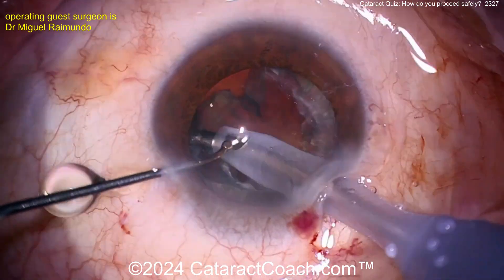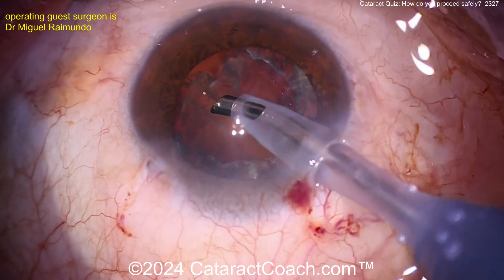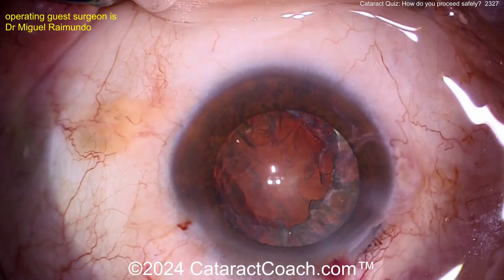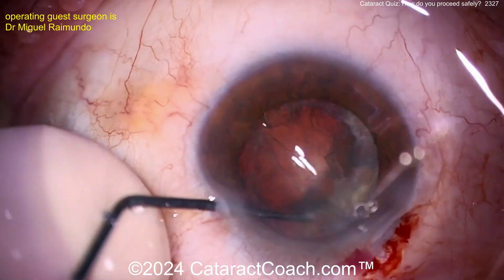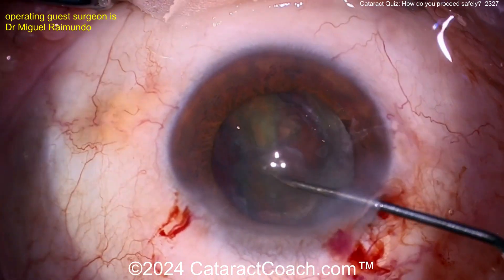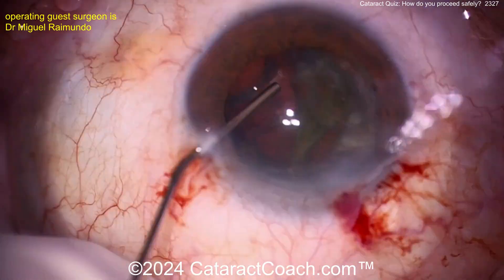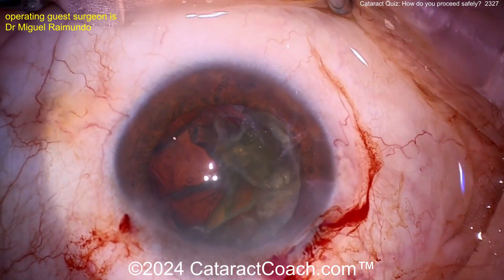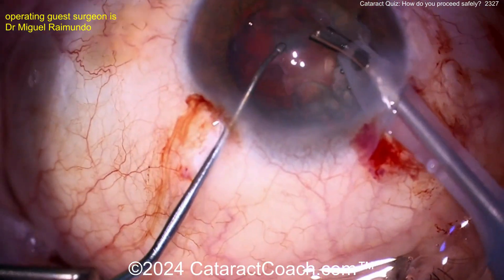When you get that shell out of the eye, don't just pull the probe out because who knows what's happening with that posterior capsule. Intravitreal injections are so common now in the USA — there are many more intravitreal injections done per year than cataracts, making it the number one procedure in all of ophthalmology. Now the surgeon is going in with a cannula to bring up that epinuclear shell. Get it up to the iris plane in the anterior chamber, using viscoelastic as a smart barrier.